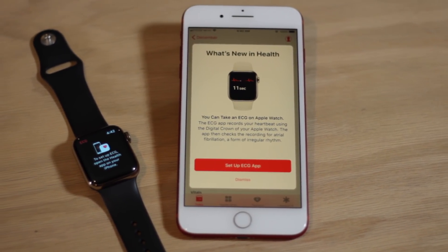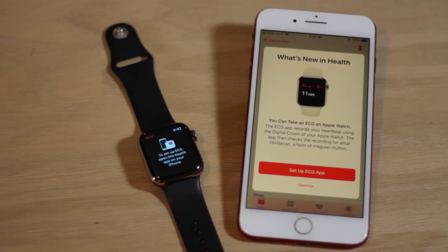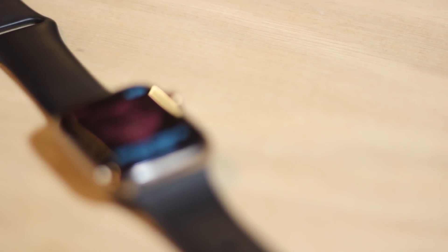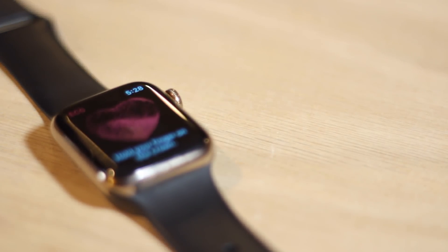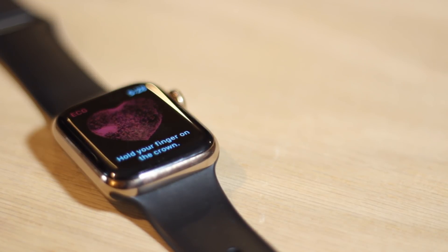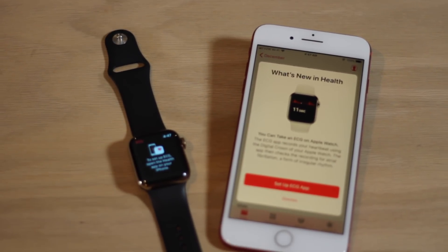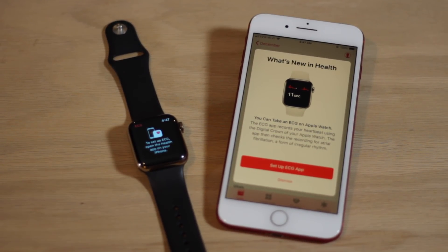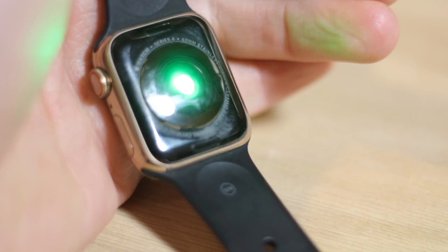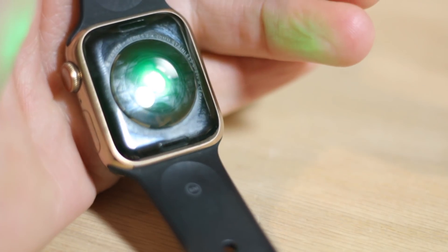What's going on everybody, Ian here for Cult of Mac, and this is our first look at the new ECG feature of the Apple Watch Series 4. An electrocardiogram, abbreviated ECG or EKG, is a test that records the electrical activity of the heart. It can be used by medical professionals to diagnose a multitude of health issues, including atrial fibrillation, or an irregular heart rhythm. With Apple Watch Series 4, Apple updated the sensors in the device to allow for ECG tests, giving you the ability to check for irregularities and even share the results with your doctor.